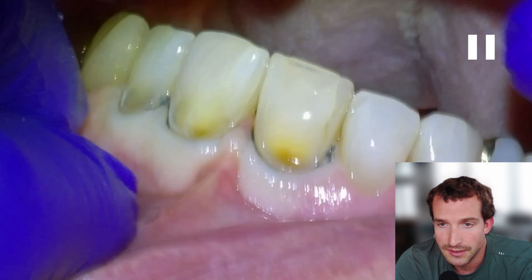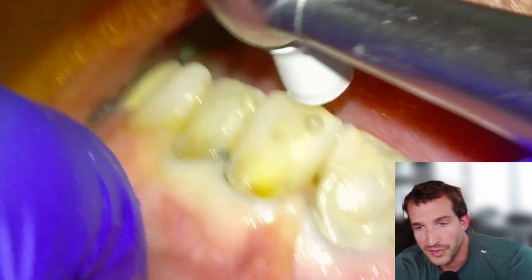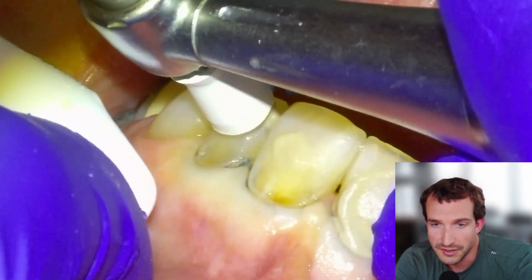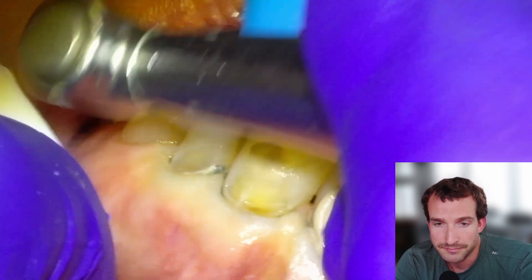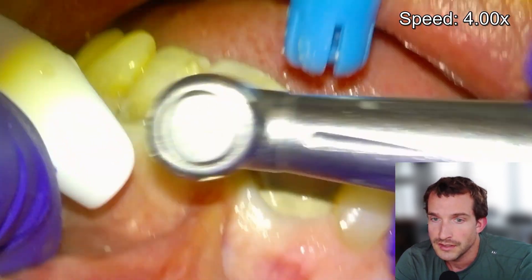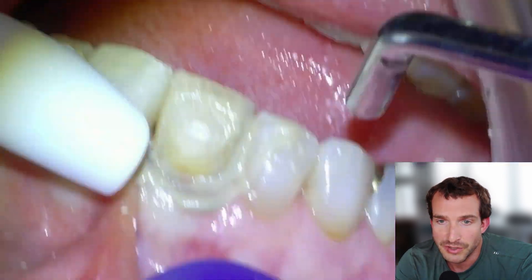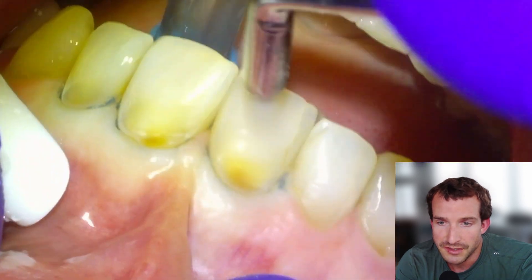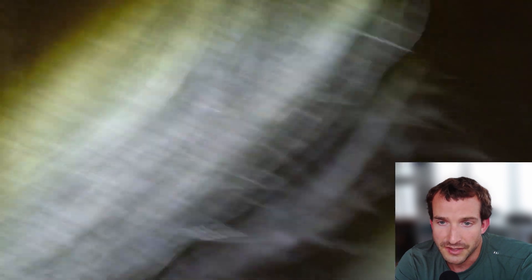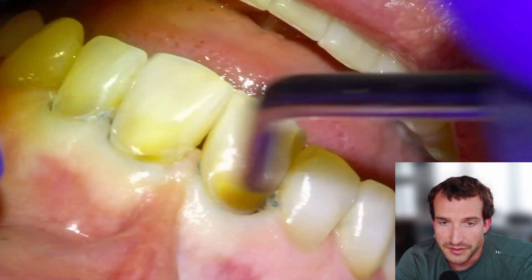We'll pumice to clean any plaque or pellicle off in preparation for bonding. We're going to use resin-modified glass ionomer cement, Fuji 2. Once we've given it a once-over with pumice and a polishing cup, we'll give it a thorough rinse and it will be ready to condition for bonding. I like to use a five-second phosphoric acid etch for my glass-based restorations.